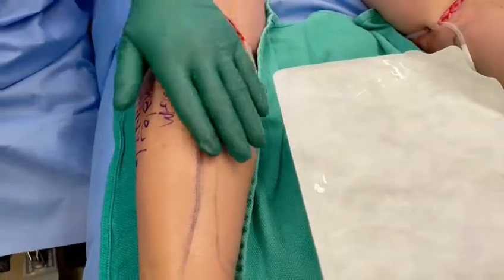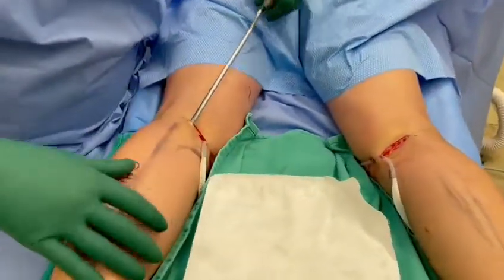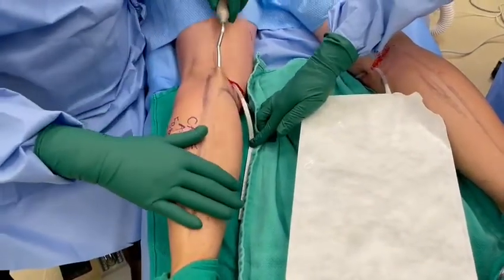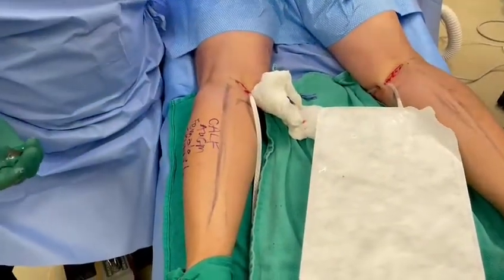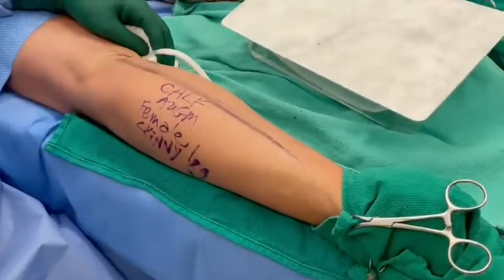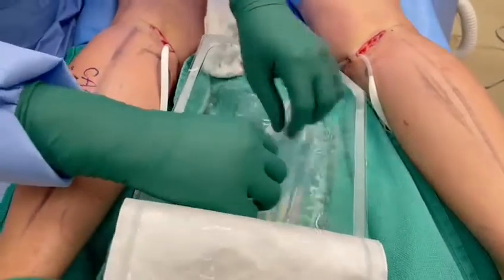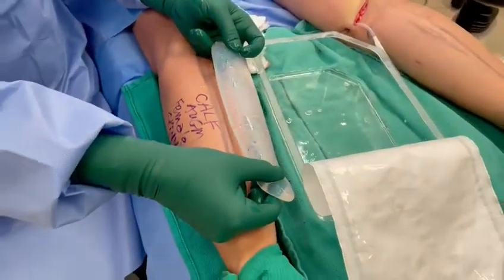I prepared a pocket. Can I have my bayonet dissector please? The dissection is already done. I am under the fascia. You can see I've created a pocket all the way to the lower ankle, so this is a full lower leg augmentation. It's a very common implant I use for our ladies — also for patients with club feet surgery in the past, and patients with polio where they lack the inner curvature of their lower legs. I'll show you the implant. It's a beautiful, solid implant — not like a gel implant as we have with breast. It's nice and soft, very spongy. It will fill up the inner calf nicely.